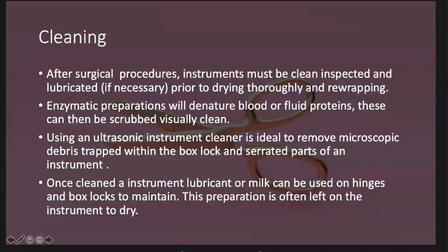Instrument cleaning. After surgical procedures, instruments must be inspected and lubricated prior to drying thoroughly and rewrapping. Enzymatic preparations will denature blood or fluid proteins. These can then be scrubbed visually clean.